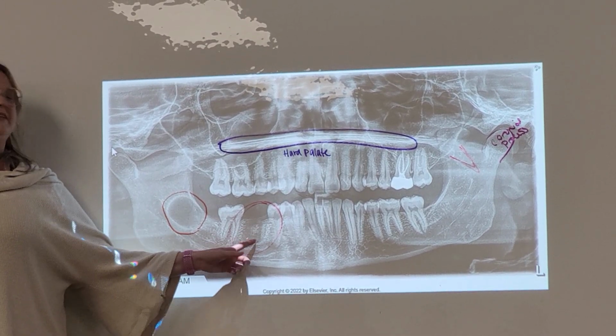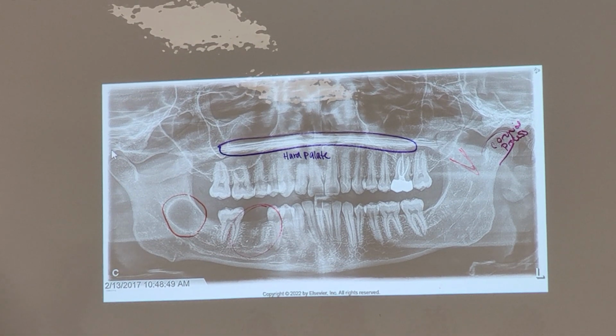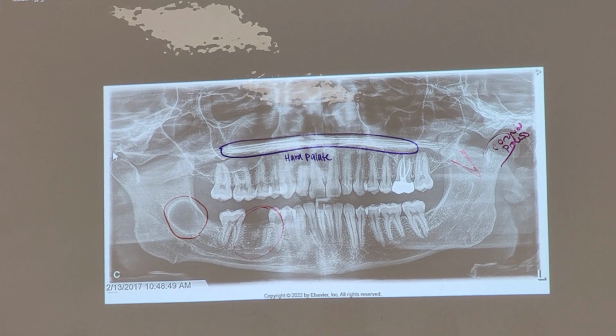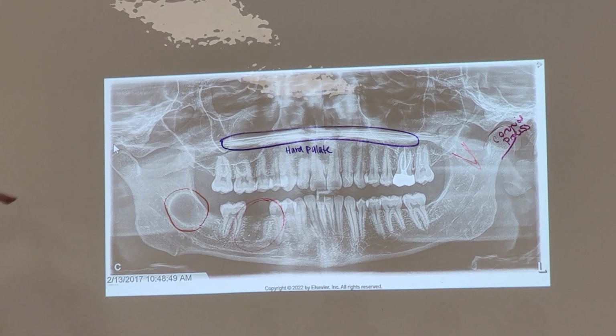I don't know exactly, but I do see this occasionally. In fact, I thought at first this was my pano, but it's not, but I do have a pano very similar to that.